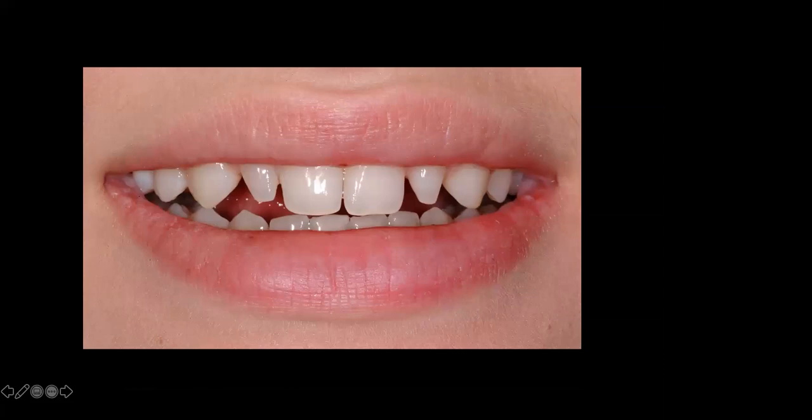It's all about absolute essence, and the contrast between white and black is very, very harsh compared to the contrast between white and pink. So sometimes these kids figure out that if they put their tongue behind their teeth, it doesn't look as bad. So here she is. I told her to pull her tongue back, and you can see that she has undersized lateral incisors. And remember, the orthodontist asked me to do some bonding.